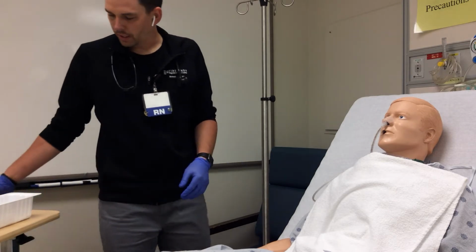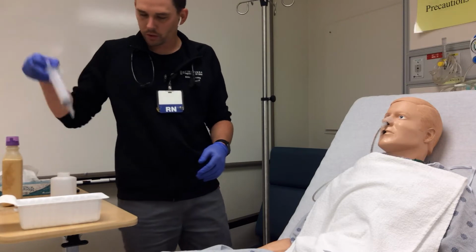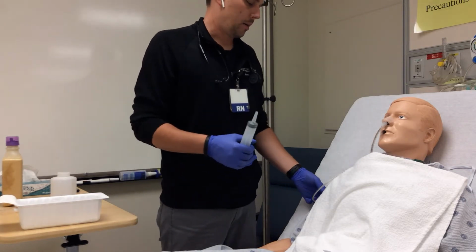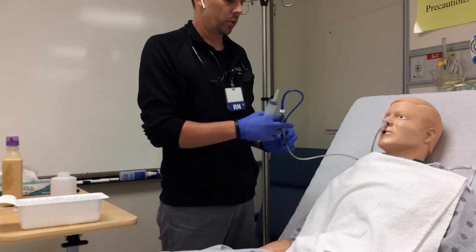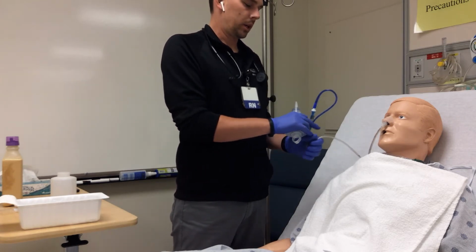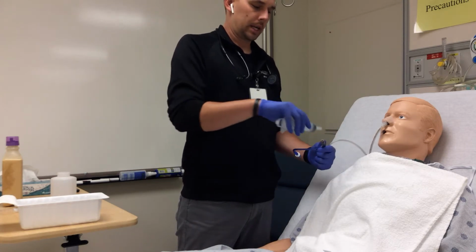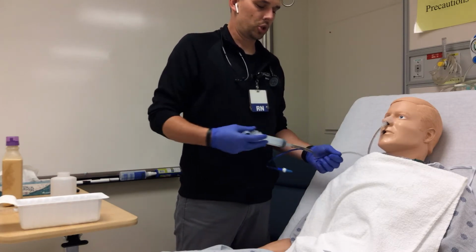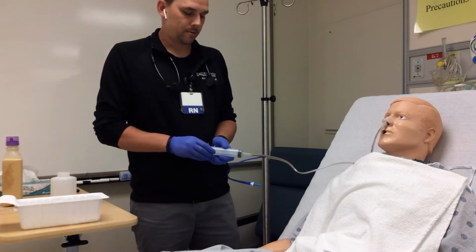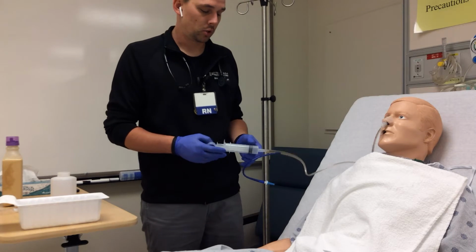So first thing we want to do is, again, workable height, get that side rail down, and we want to check placement with gastric content, and we also want to check that gastric residual volume. So remember, we are clamping our NG tube, removing the blue port here, connecting our 60 ml syringe, and we are pulling back, again, looking for any gastric content coming up the NG tube.